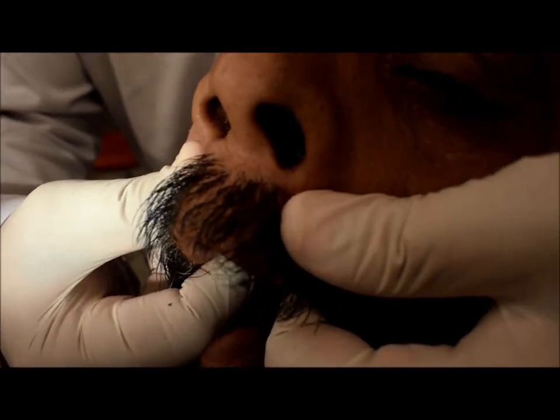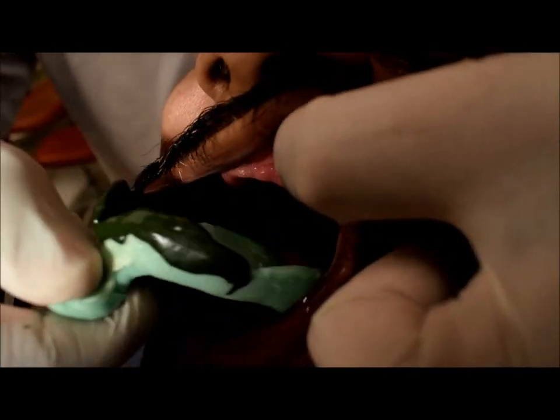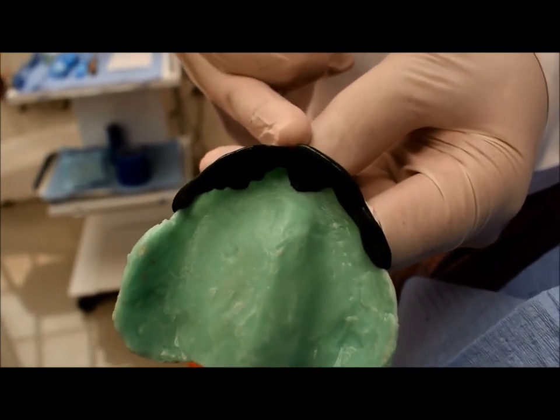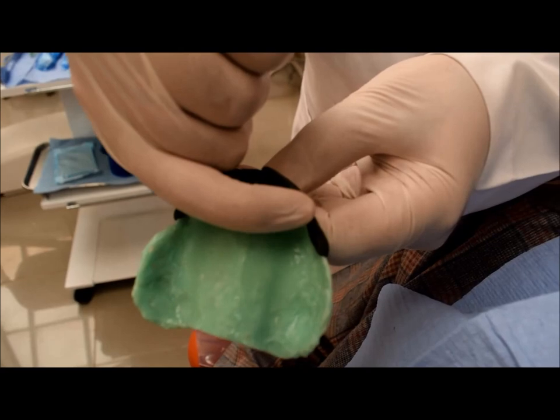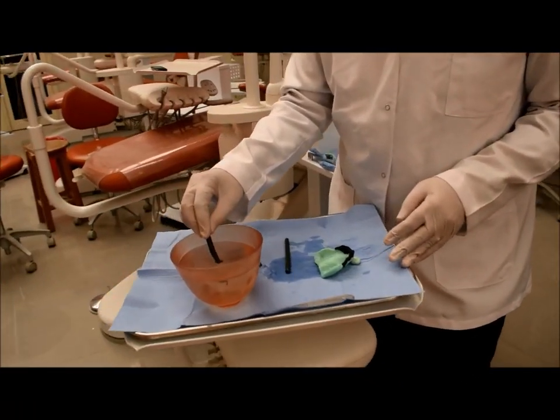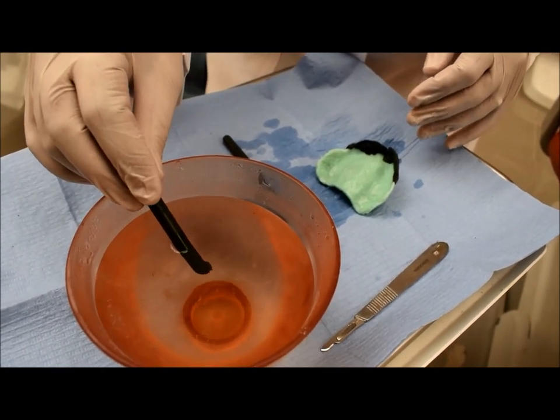You can ask the patient to suck your finger — this is the same physiological movement as moving the lip downward and inward. After that, I remove the tray. I find that the labial frenum is cutting the green stick compound, and the labial vestibule is all smooth and rounded. The buccal frenum also appears. Every now and then, I have to check that the water is still hot; if it starts to cool, use fresh hot water.